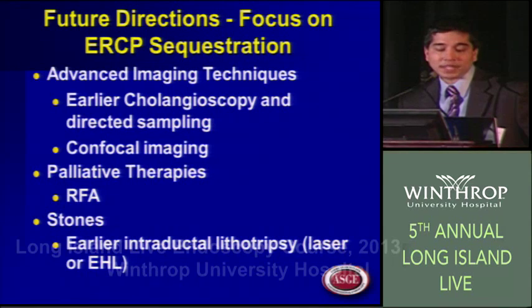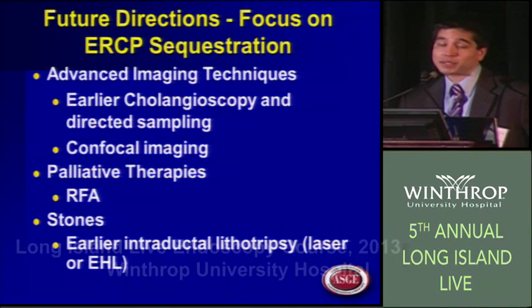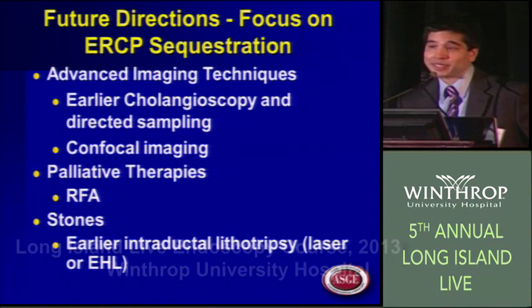I tell patients there's a 90% chance that we'll clear your stone with a follow-up, meaning after referral, 90% chance that they'll have their stone cleared that day. Most of them are pretty happy with it. Some want to hear 100%, but that's the reality.